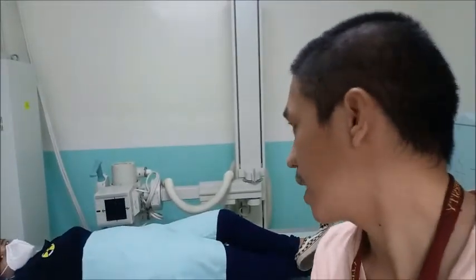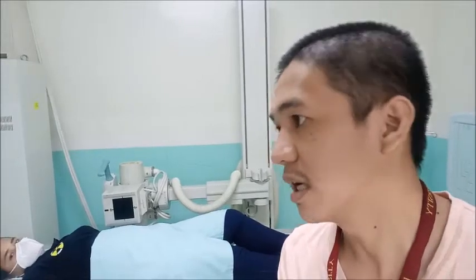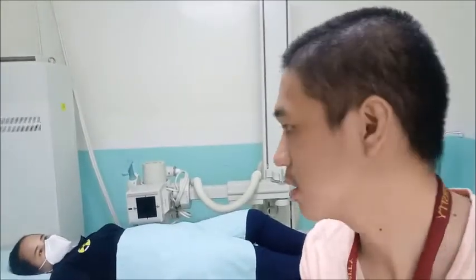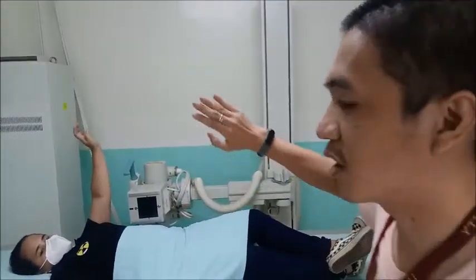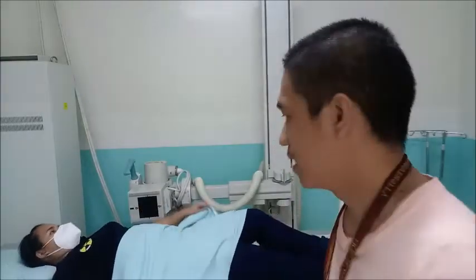And if the condition of the patient is right-sided pleural effusion, the position of the patient should be right lateral decubitus. So this is the right side of the patient, so the patient faces the tube with the right side.